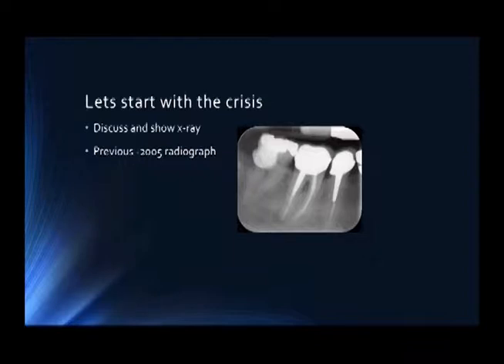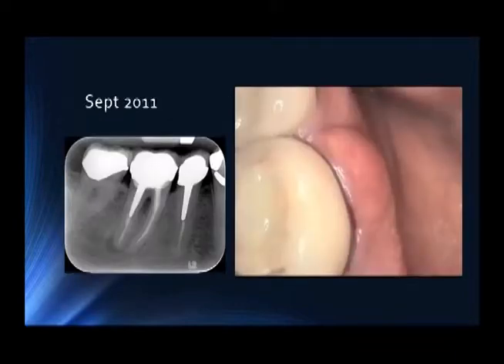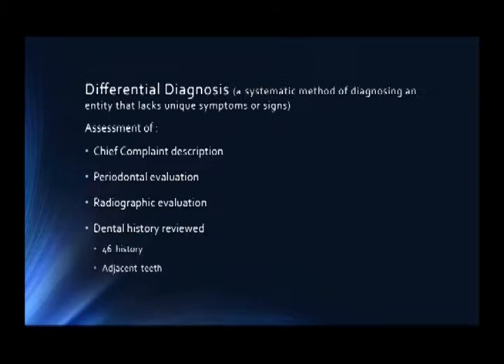And all of a sudden we come fast forward to September of 2011, and our client shows up with pain and swelling, as you can see, and something's definitely going on there. And unfortunately, we had to then evaluate what are we going to do next. So then we end up with a differential diagnosis, because there was no true flag telling us what exactly was going on here. There certainly was swelling and pain, and that would be part of the chief complaint.